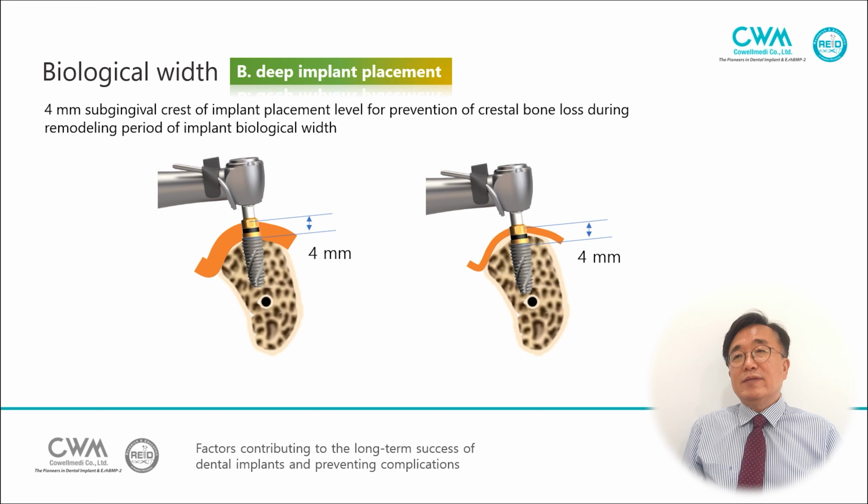So deep implant placement could prevent marginal bone loss. So in a thin biotype site, the implant is placed in a sub-crestal position.